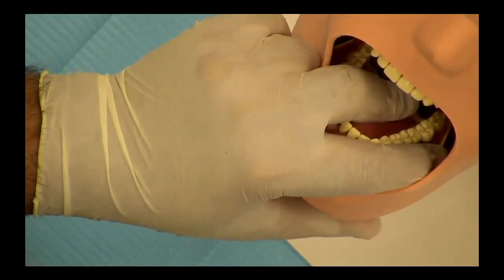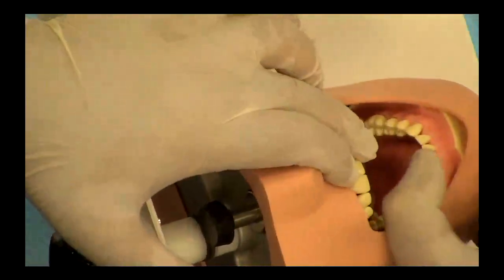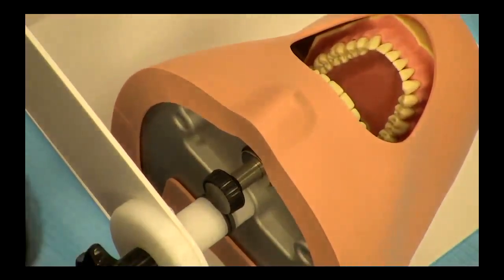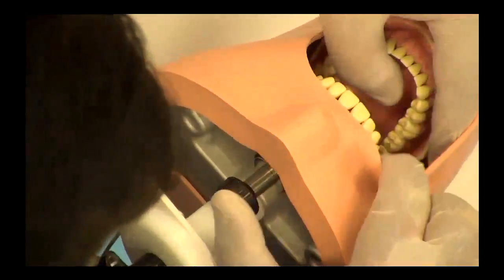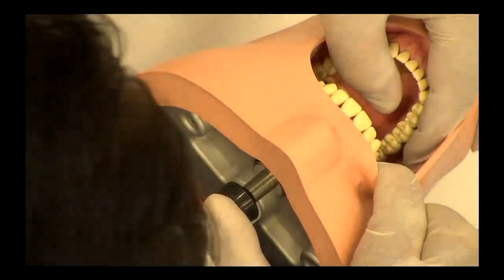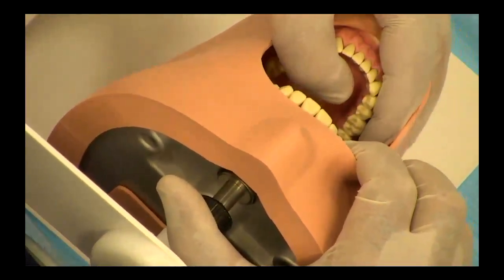Now, if you are a right-handed operator, as we discussed in the position of the extractions for the mandibular right posterior teeth, you will stand behind the patient, your forefinger on the buccal side, thumb on the lingual side, and these three fingers supporting the mandible.